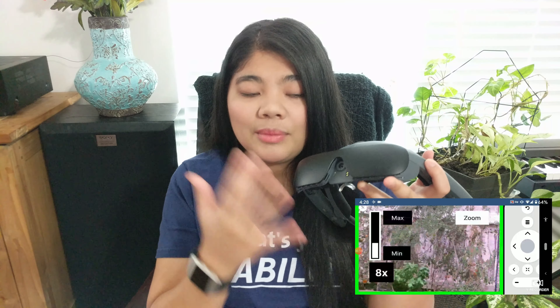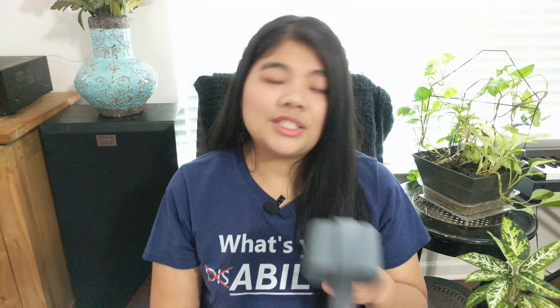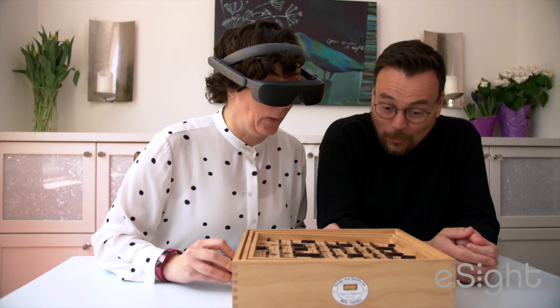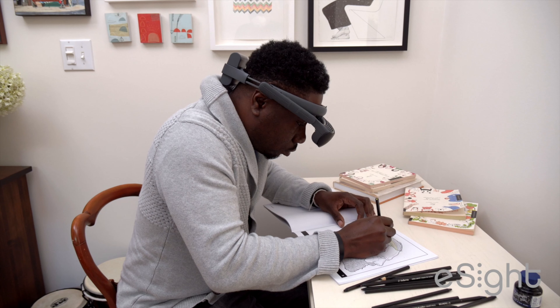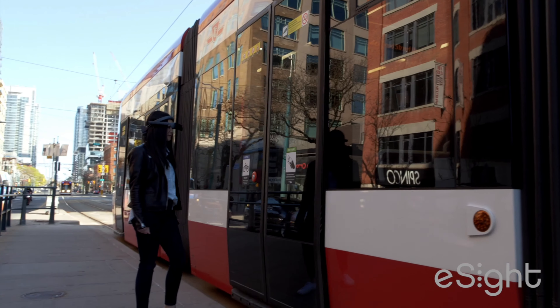They have a camera on the front and screens that you put right in front of your eyes, and you can zoom in, change the filters, change the mode, and using the vision that you still have, see the world better. You can use it for reading, seeing people around you and faces, as well as walking around, using the computer, working, and a lot of other tasks as well.